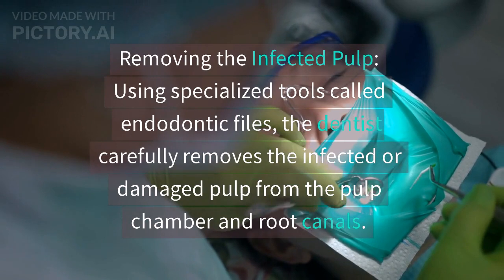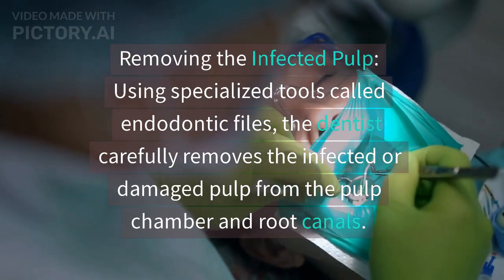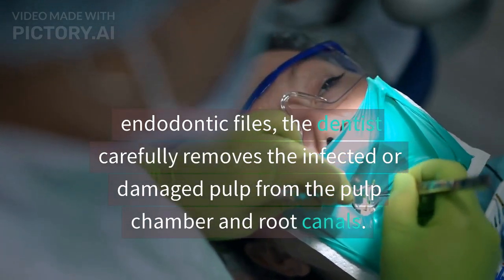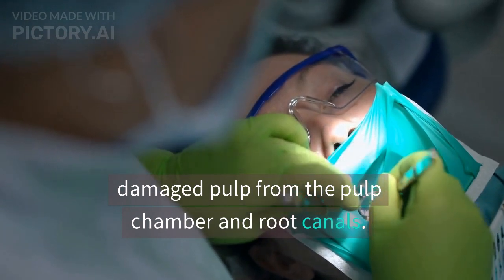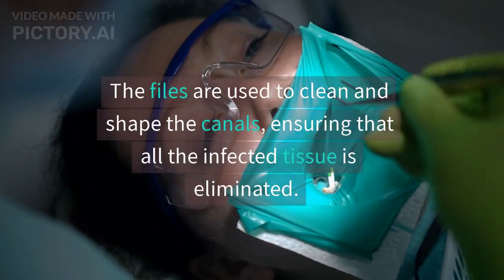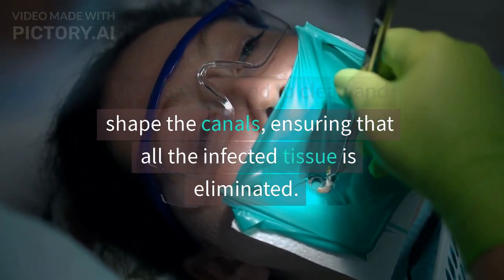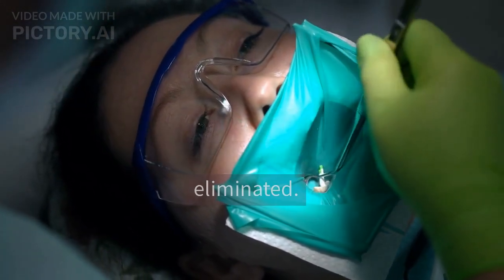Removing the infected pulp. Using specialized tools called endodontic files, the dentist carefully removes the infected or damaged pulp from the pulp chamber and root canals. The files are used to clean and shape the canals, ensuring that all the infected tissue is eliminated.